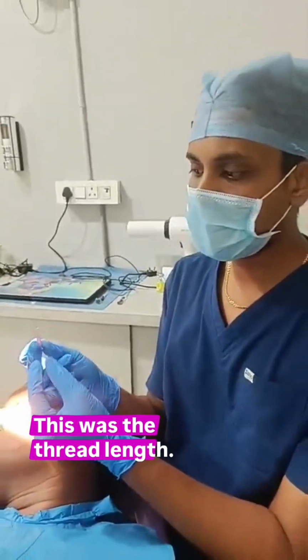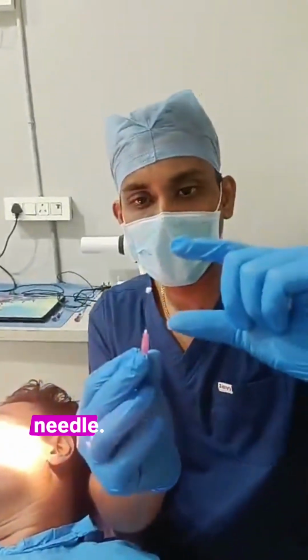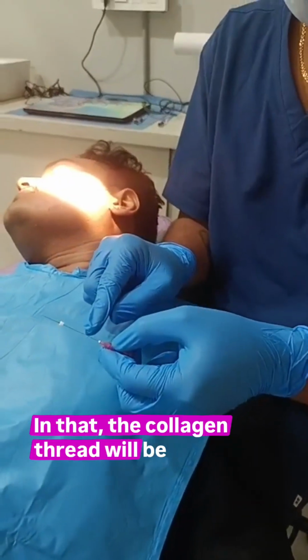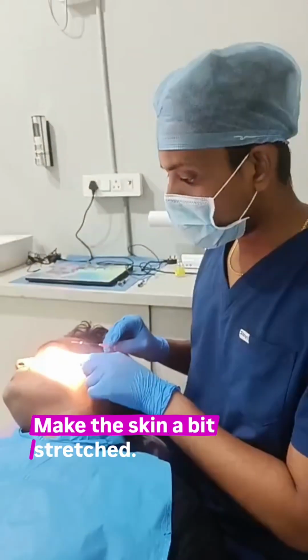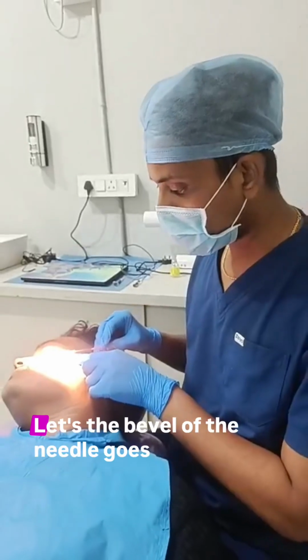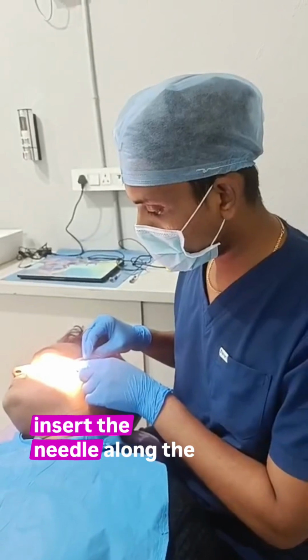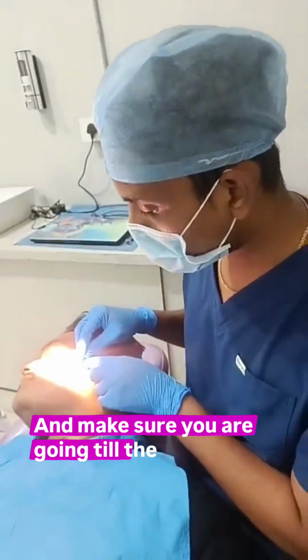Is this visible? This is the thread length. The thread will be only up to 2/3 of this, which is the entire length of the needle. In that, the collagen thread will be only till 2/3. So all you need to do is take it and make the skin a bit stretched. Let the bevel of the needle go towards the skin side, and then insert the needle along the subcuticular plane. Make sure you go till 2/3 of the syringe.